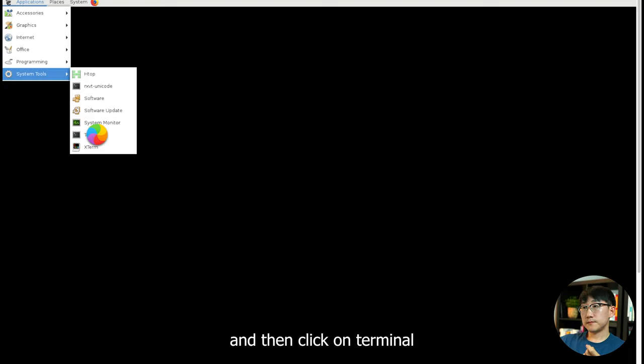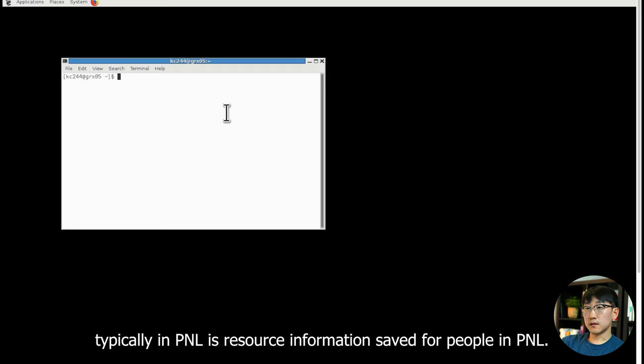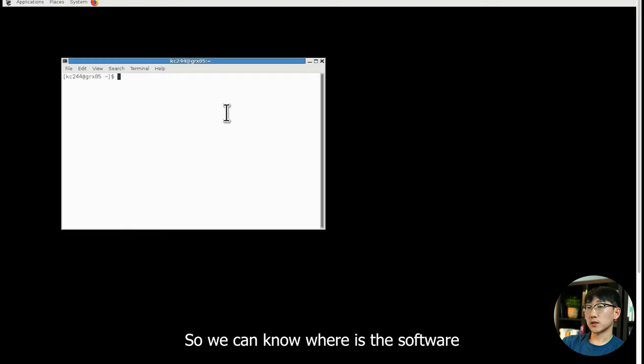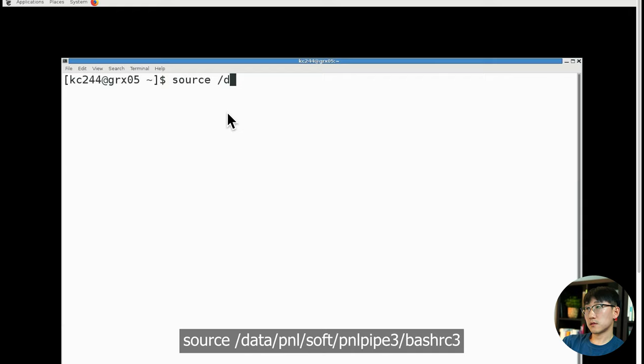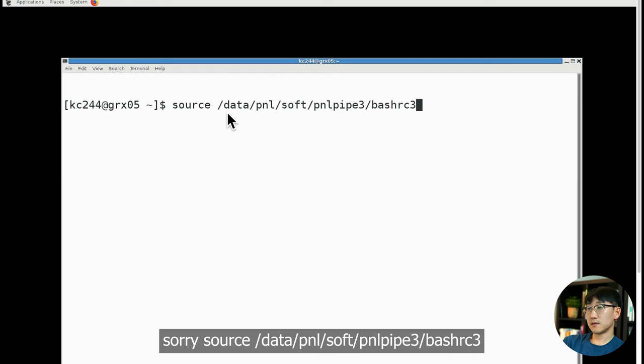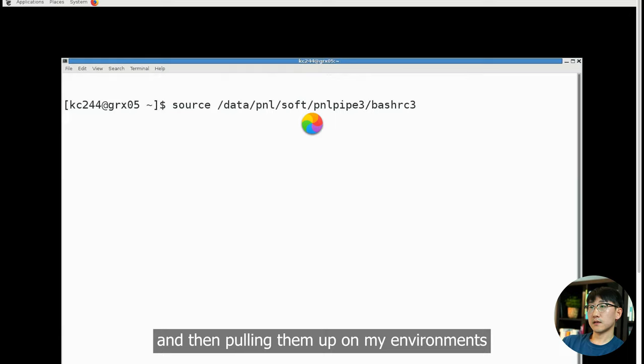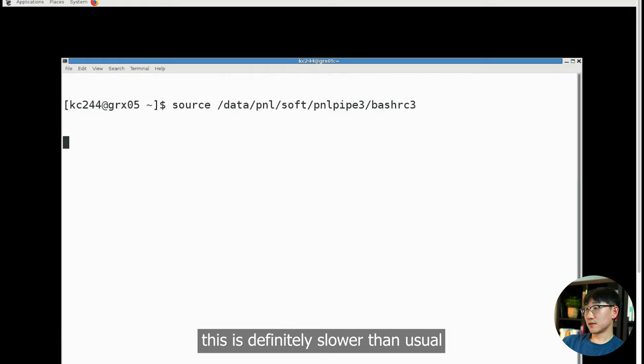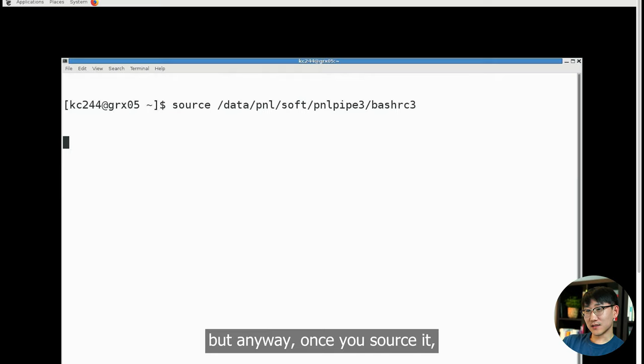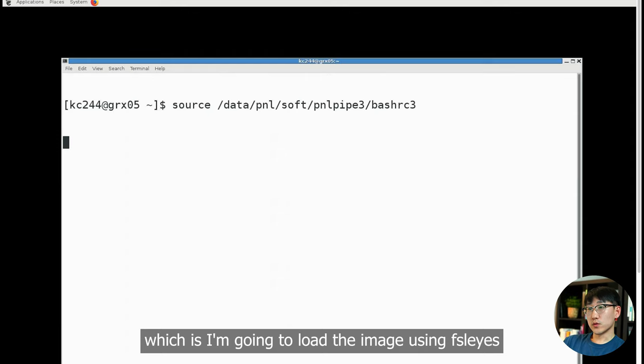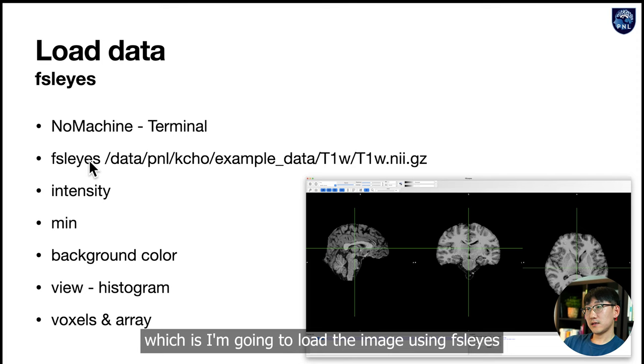You receive a terminal. What you do in the beginning, typically in PNL, is source information saved for people in PNL so we can know where the software and data is. So we do source bashrc3. My terminal is loading the information saved in this file and pulling them up on my environment. Once you source it, you'll be able to use the same command line that I'll be using.